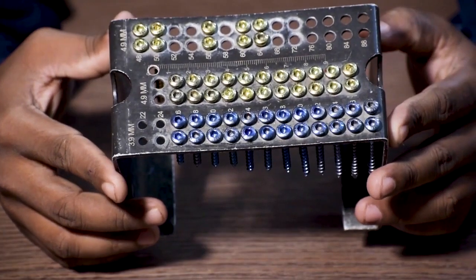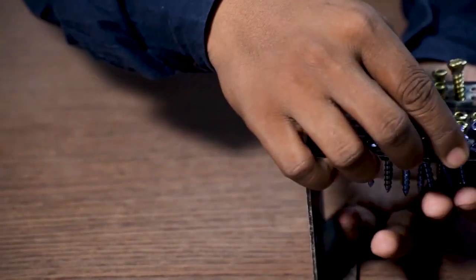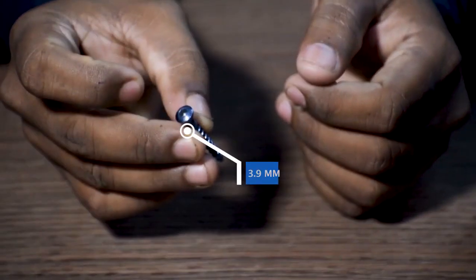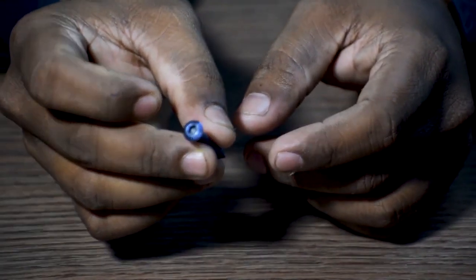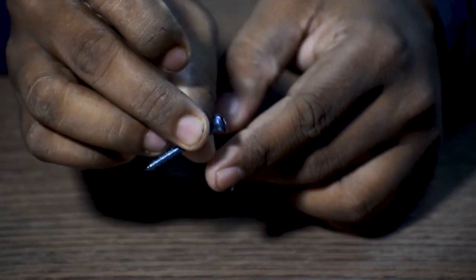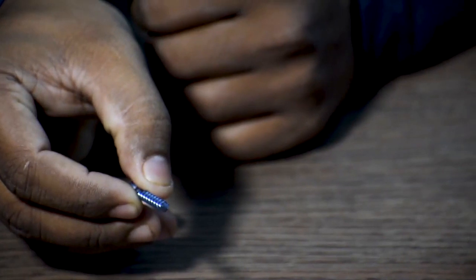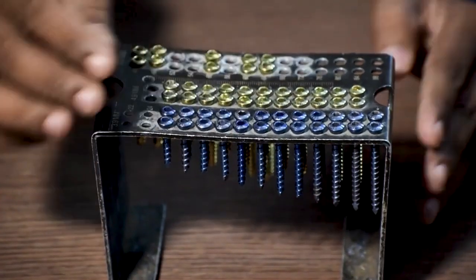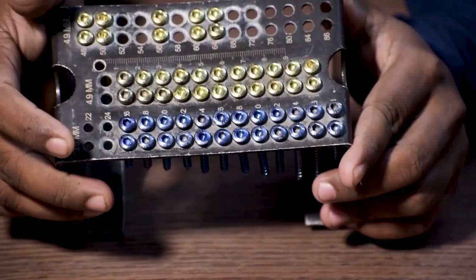Let us check out the interlocking bolts used for the tibia interlocking nailing system. This is a 3.9 mm interlocking bolt — this goes in the distal part of the 8 mm diameter tibia nail. It is available in lengths of 26 mm to 50 mm, with a 2 mm difference in between.